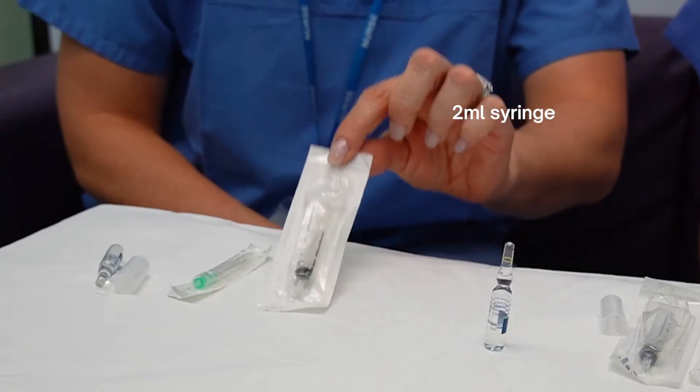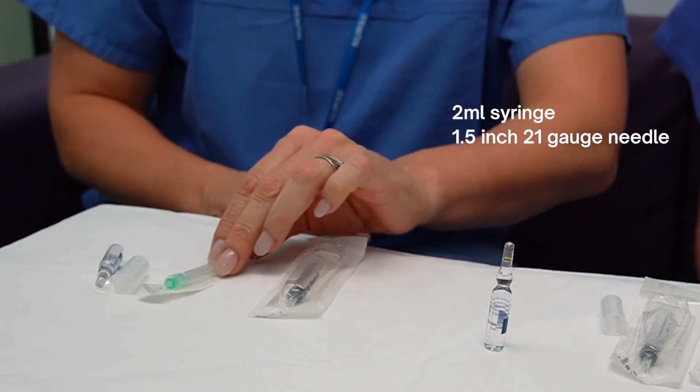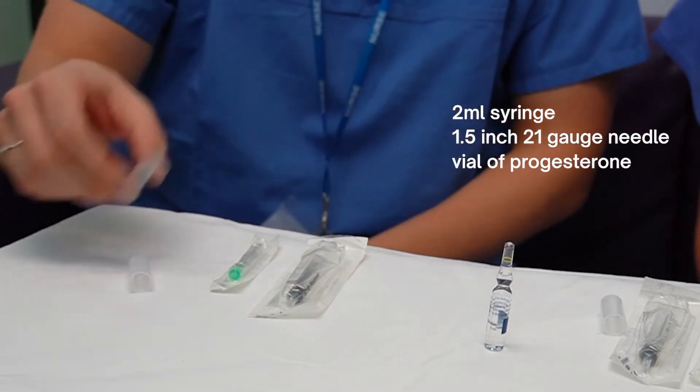To do your injection you will need a 2ml syringe, a 1.5 inch 21 gauge needle, a vial of the medication, and you can use a little plastic cap to help break the top off.